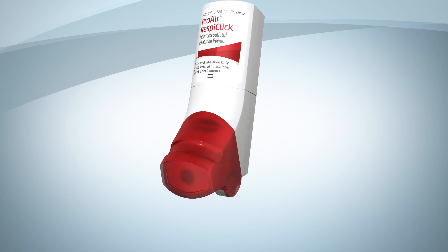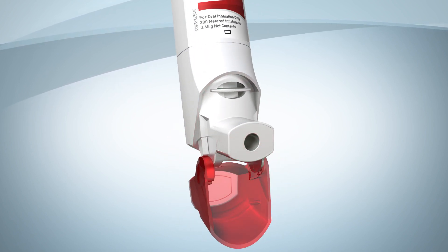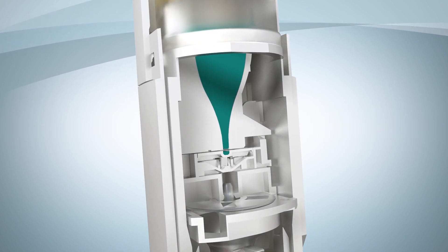Hold the inhaler upright. When you open the red cap, you'll hear, and you may even feel, a click. This means that an exact dose of medicine has been prepared and is now ready to breathe in.